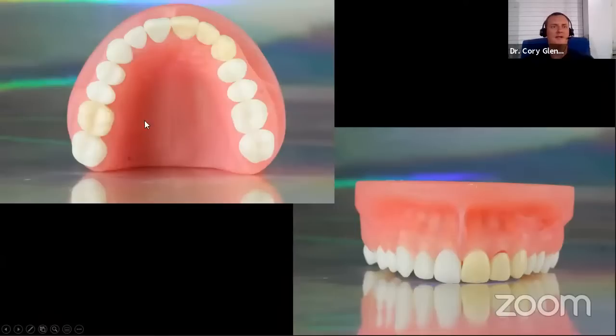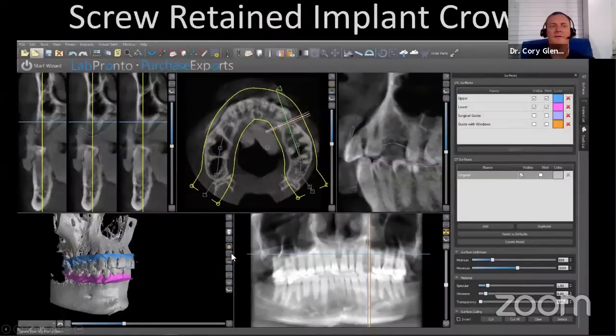Went ahead and printed the bridge and the single crown, and you can see the fit of those. I wasn't holding it down with my finger here, so it's unseating on the margins just a little bit right there. But the fit on these is excellent. It really is comparable with most of your ceramic crowns. So just a couple clinical cases.